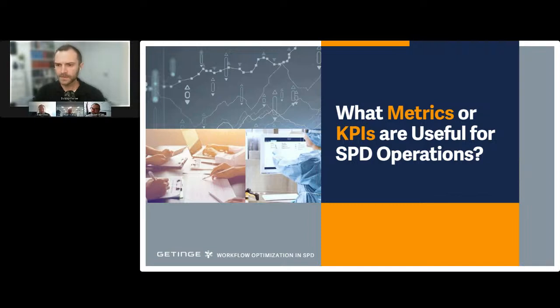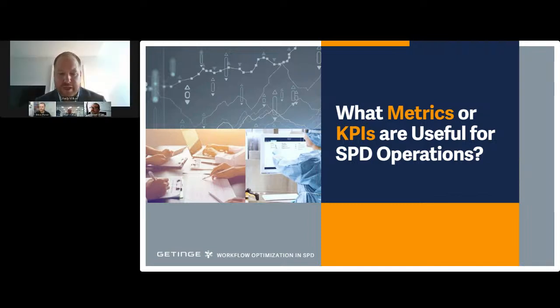Absolutely. A little underutilized resource within the hospital is your performance services team, management engineering. If you have data, but you don't have the ability to truly trend it, or you just don't have that knowledge, they can come in and partner with you and say, give me your data points, and they can then trend it and go, this is what we're seeing. You're processing X amount of instruments per hour. And now you have a quantitative measurement, right?